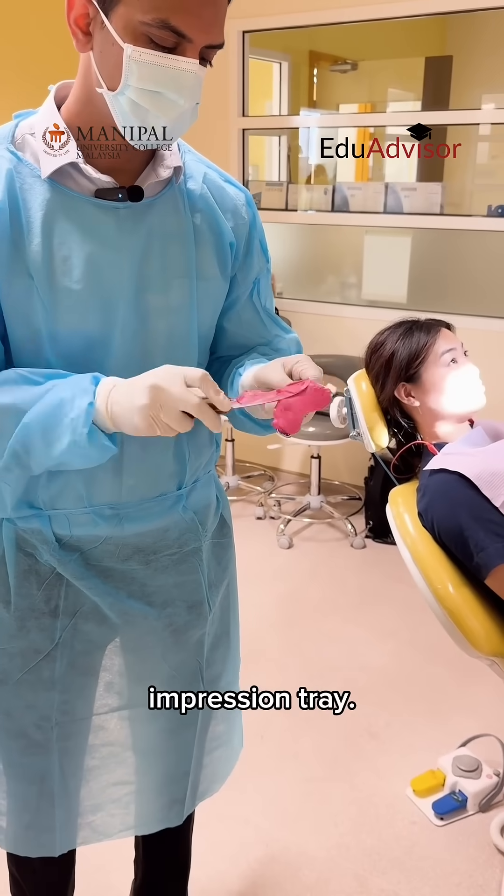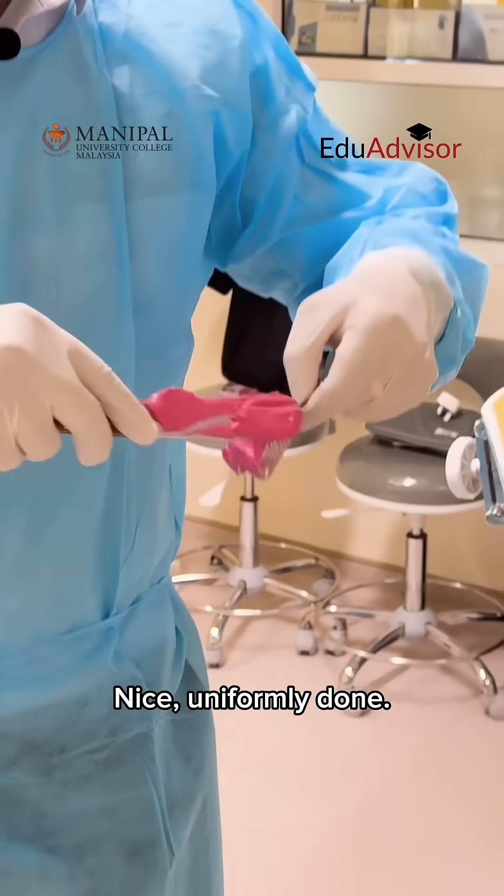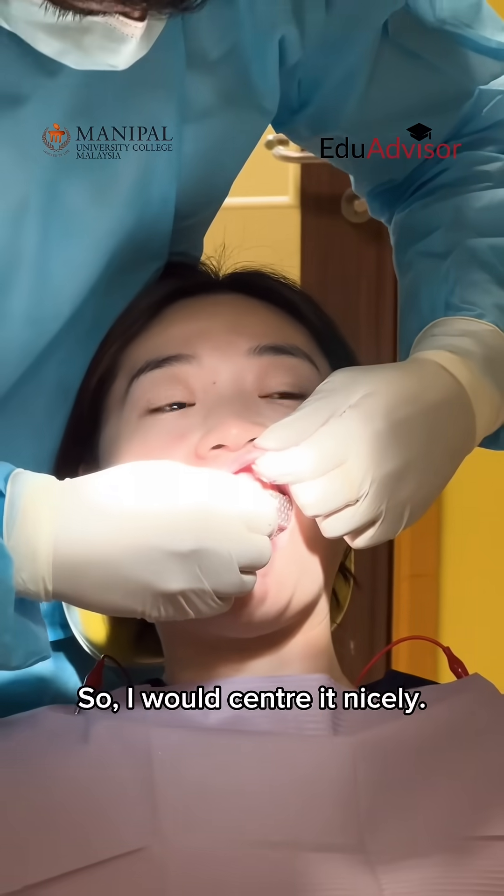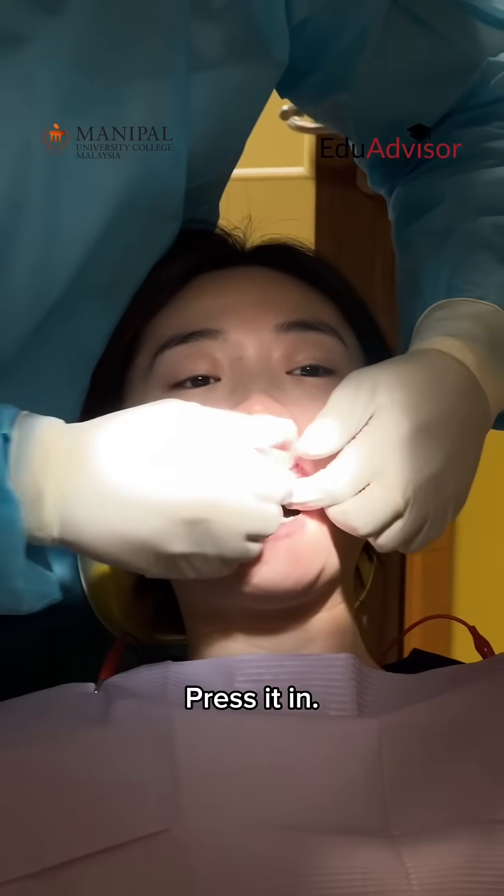So I load it onto the impression tray, nice and uniformly done. So now I'm going to put it into the patient's mouth. I would center it nicely and press it in.